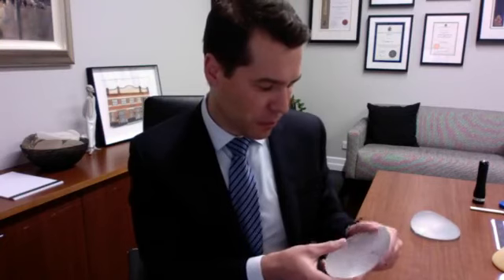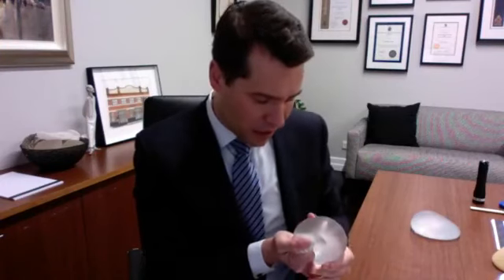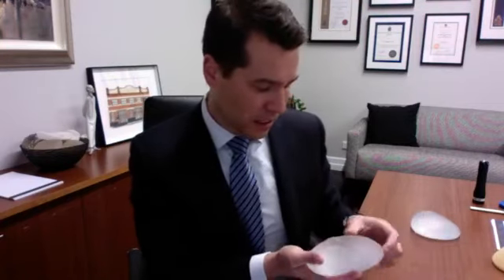Texturing also is present in the Motiva implant, and a lot of you are probably aware of Motiva implants now. We've been using them for a period of time now in Australia, and they have been used internationally as well. But these are a nano-textured implant. And so a nano-textured surface under the electron microscope does have a variation in the surface, which is not as deep or as creviced as a micro or a macro textured surface, but it still has a change compared to the smooth. So it is still a textured implant.